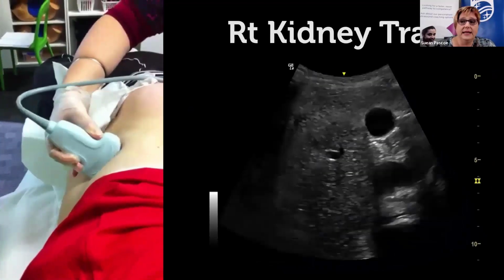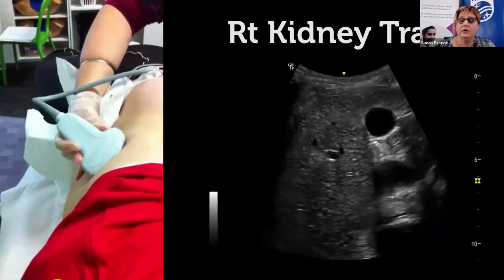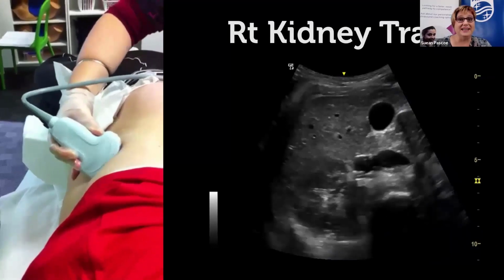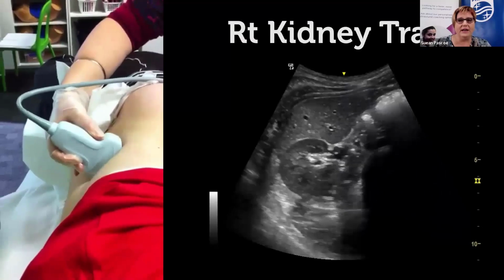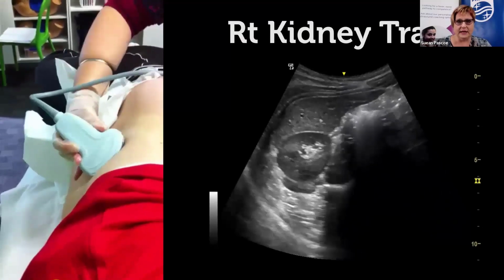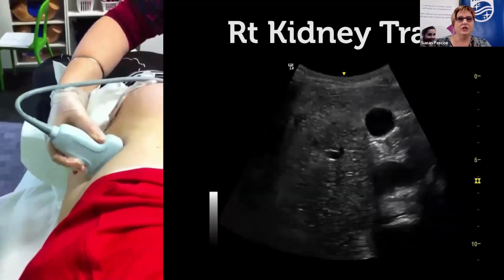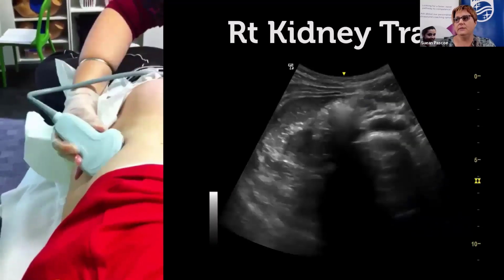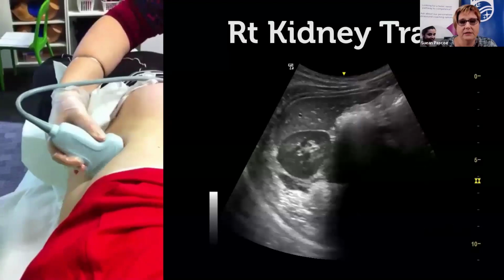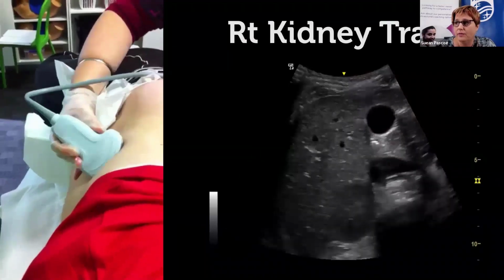When we are scanning in transverse, again, you remember that the kidney is about 10 to 12 centimeters long, so you are going to have to move your probe. You may not get the whole kidney from just sitting in one stationary position. You need to slide the probe or sweep the probe over the length of the kidney to be able to visualize all the way from the upper pole to the inferior pole.